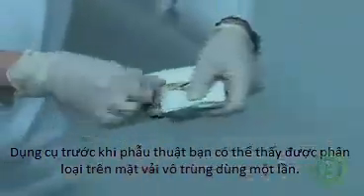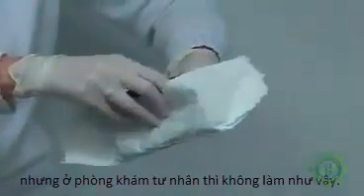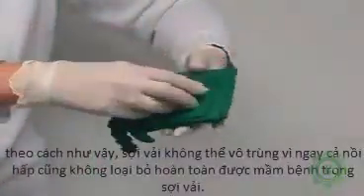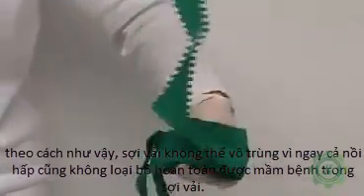Frequently, washable linen cloths are used instead of disposable articles. These are sometimes sterilized in an autoclave, but some doctors' offices do not do this. Either way, the linens are not sterile because even an autoclave cannot completely remove germs from the linens.